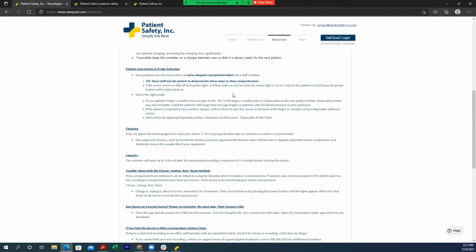I would either recommend going through that patient video or going through the patient instructions included in the case, just to confirm that they fully understand what is being asked of them when they're wearing this unit.